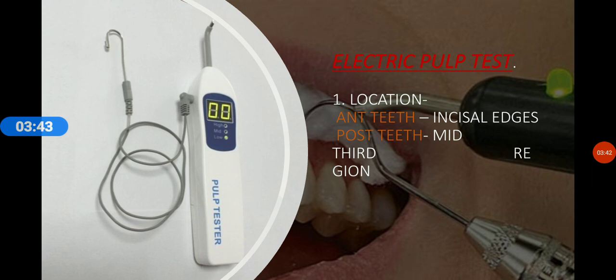Now the electric pulp test. Location. For anterior teeth, we apply it on the incisal edges because the A delta fibers are most predominant in this region. Whereas in the posterior teeth, the A delta fibers are predominant in the mid-third region. I hope it is clear, guys. Why do we apply these sources on particular locations, right?